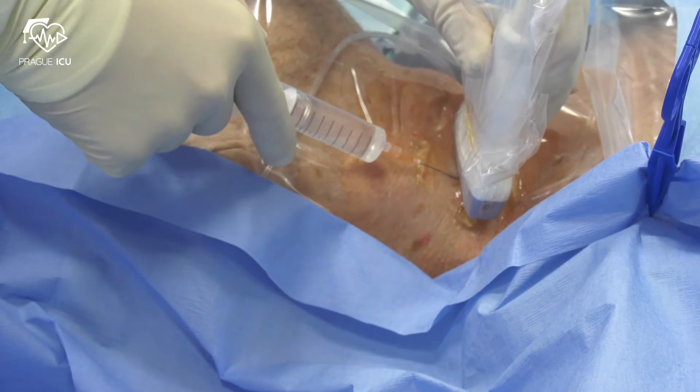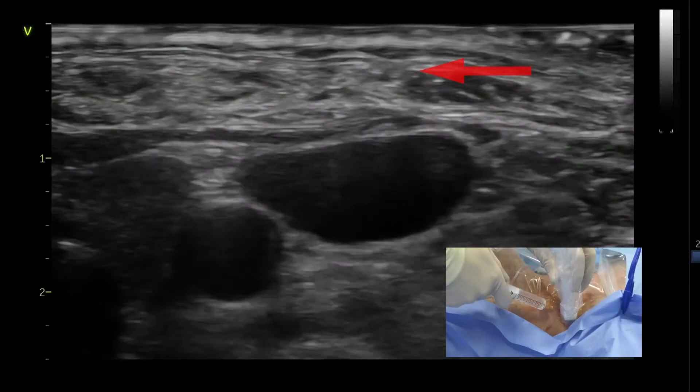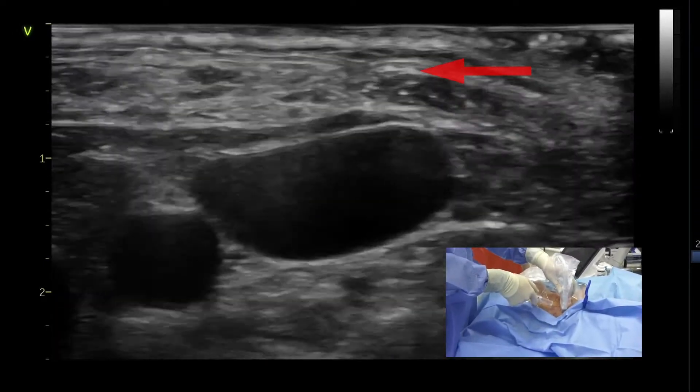In awake and minimally sedated patients, skin should be infiltrated with a local anesthetic under ultrasound guidance. Always check the needle tip.